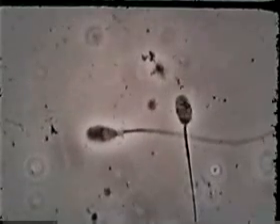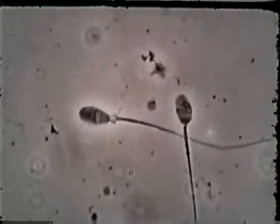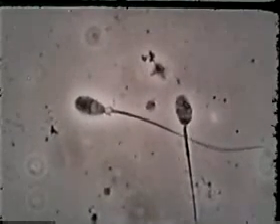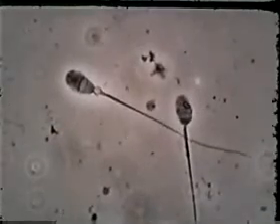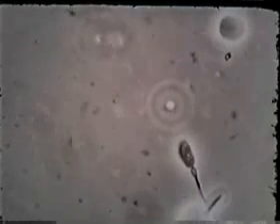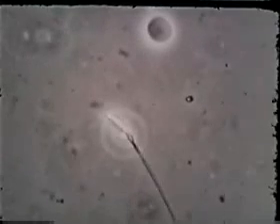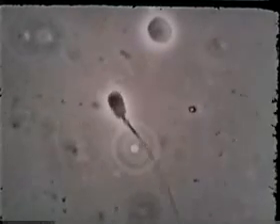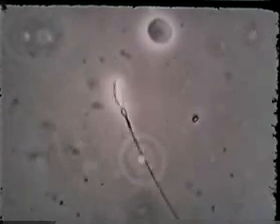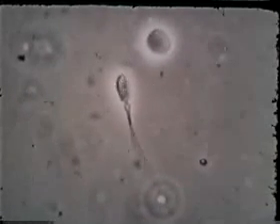Free sperm may be present also. Their flagella may be curved slightly and show mild vibratory movements. Their heads normally remain in one plane. Very occasionally, a sperm will appear to rotate slowly. The morphology of the head can be appreciated in a rotating sperm, for the edge of the head appears as a bright flash. We emphasize that the rate of sperm movement has been recorded at normal speed throughout this film.